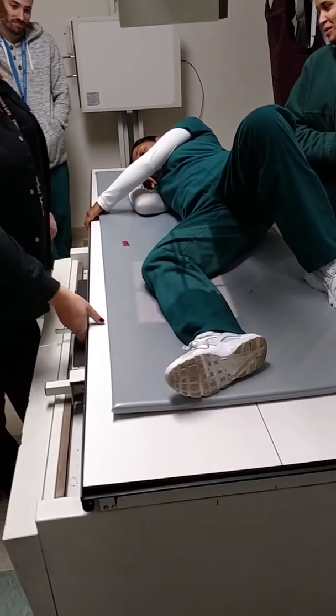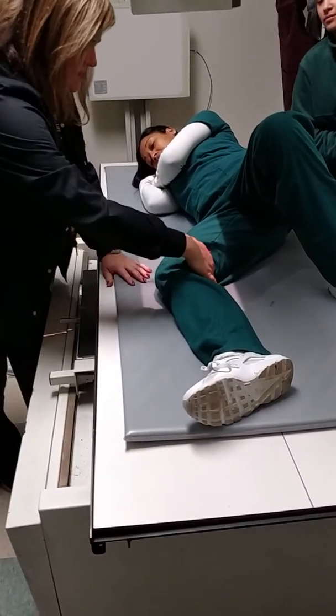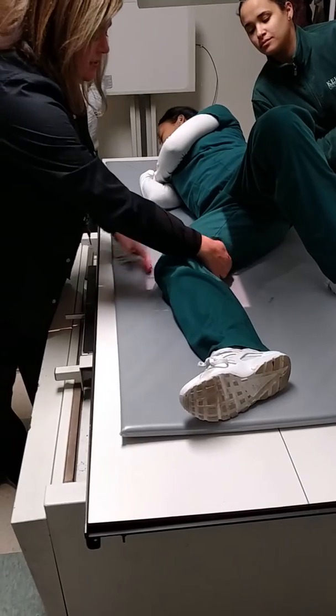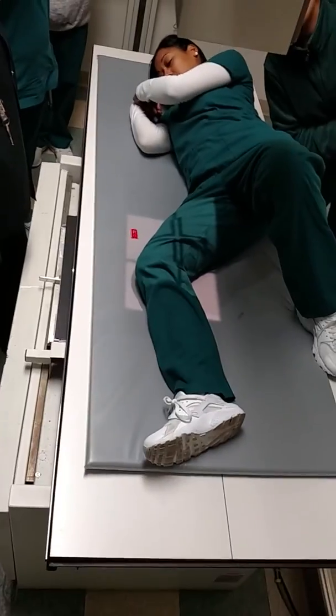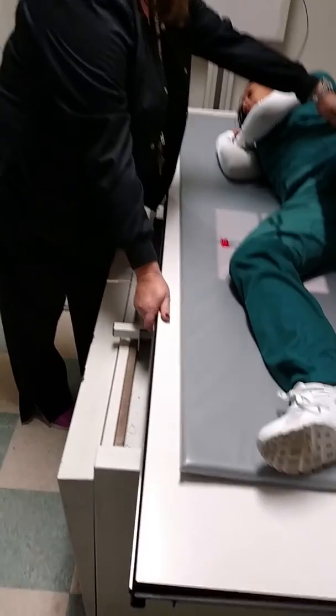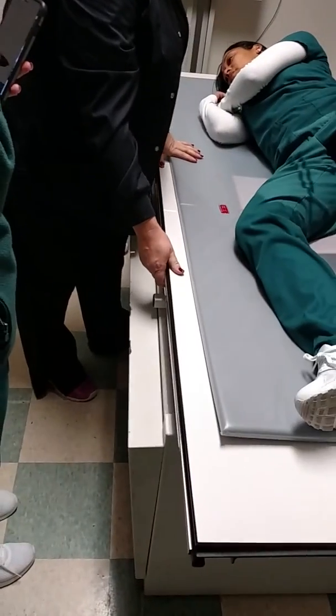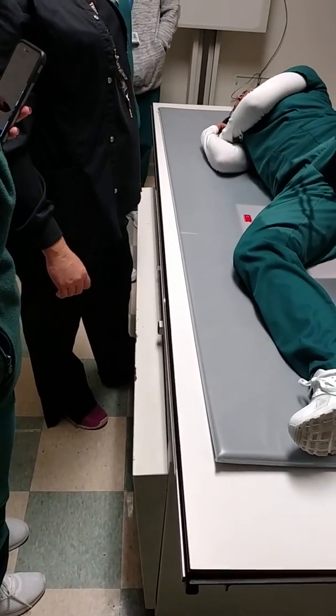All right, so now we need a lateral. So I'm going to go past the knee joint, get as much leg as I can in this one. Beep. So that's a lateral of the lower. And now I need the upper, so I'm going to put top of the light field at ASIS. Get all that leg. Beep.